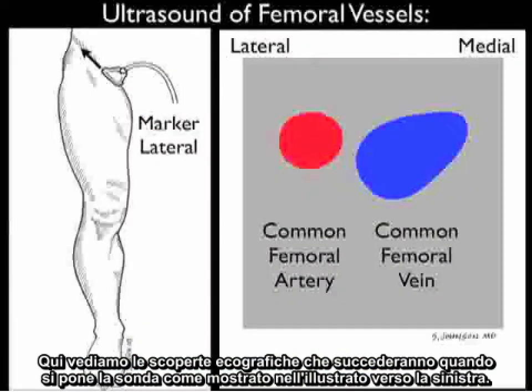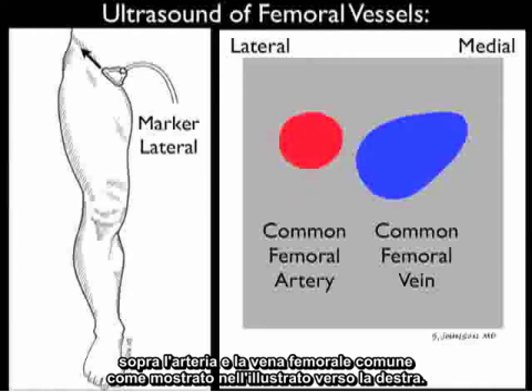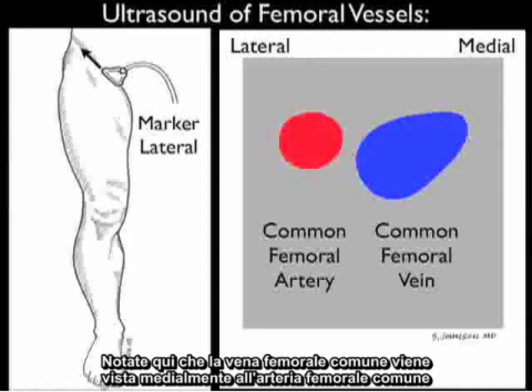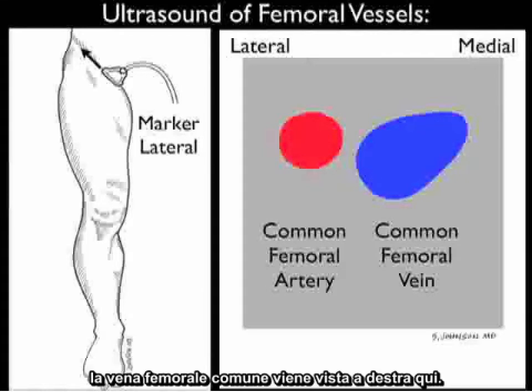Here we see the ultrasound findings that occur when placing the probe as shown in the illustration to the left. The probe is placed with the marker dot laterally, just inferior to the inguinal ligament over the common femoral artery and vein, as shown in the pictorial to the right. Notice that the common femoral vein will be seen medial to the common femoral artery, and because we have the marker dot oriented laterally, the common femoral vein will be seen to the right here.